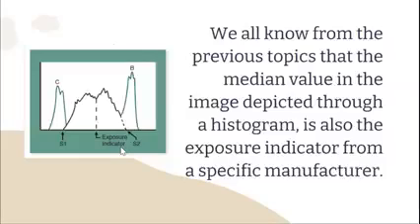So that means if ang provider ninyo is si Fuji, for example, lahi ang ilang exposure indicator and exposure indicator scale from Philips, from Alara CR and the other manufacturers. Okay? So lahi-lahi na sila. Same sa kung giingon po last time. This then becomes the target exposure indicator. Okay, ang ideal, this middle area here is a target exposure indicator.